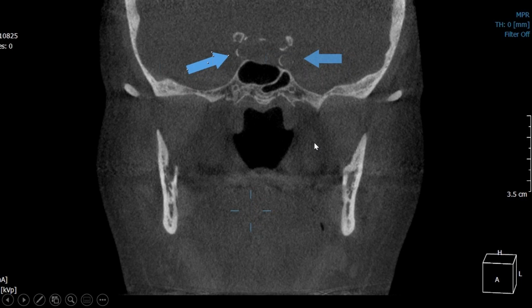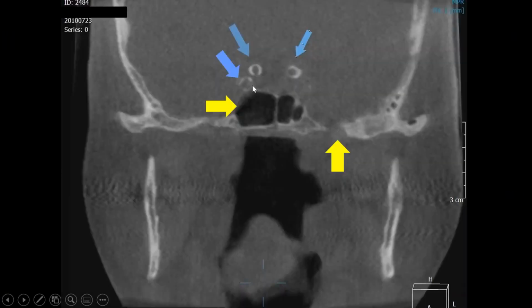So my advice to you is pay attention to the region around the sphenoid sinus and sella turcica. On here, the clinoid processes are here and here, and this loop, this loop, this loop, and this little bit of opacity here, when we thicken it out, is actually the internal carotid artery in the cavernous and ophthalmic segments curving, okay? And when we do a MIP image of those same areas, you can see how circular they look. These are not plaques, okay? These are medial arterial calcification.